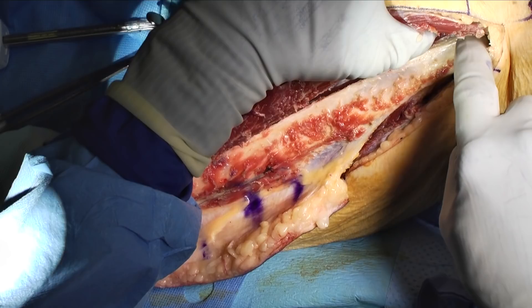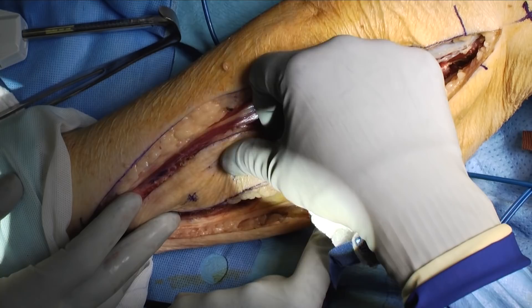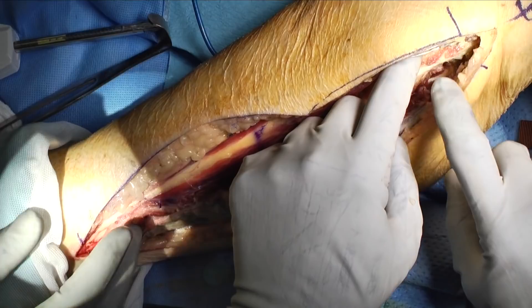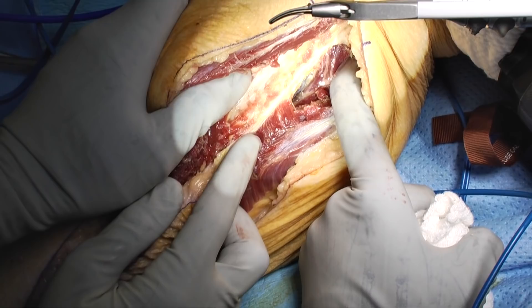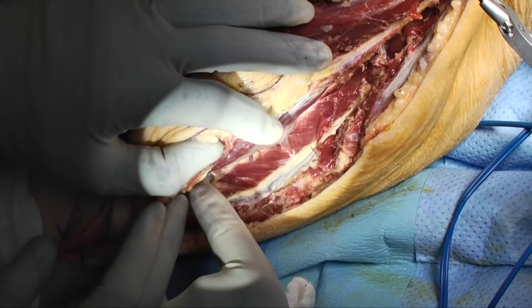Elevating this muscle loose from the fibula allows easy identification of the peroneal vessels. At this point, everything has been isolated off the fibula except for the vascular pedicle and its surrounding muscle — posterior tibialis anteriorly and flexor hallucis longus posteriorly. The perforators to the skin are coming up through the septum and can be seen on both sides of the skin. The muscle has been divided partially off the fibula, and the remainder will now be divided carefully to identify the peroneal vessels. Care should be taken to divide perforators with either a harmonic scalpel or clips, as the perforators can be quite large and bleed.